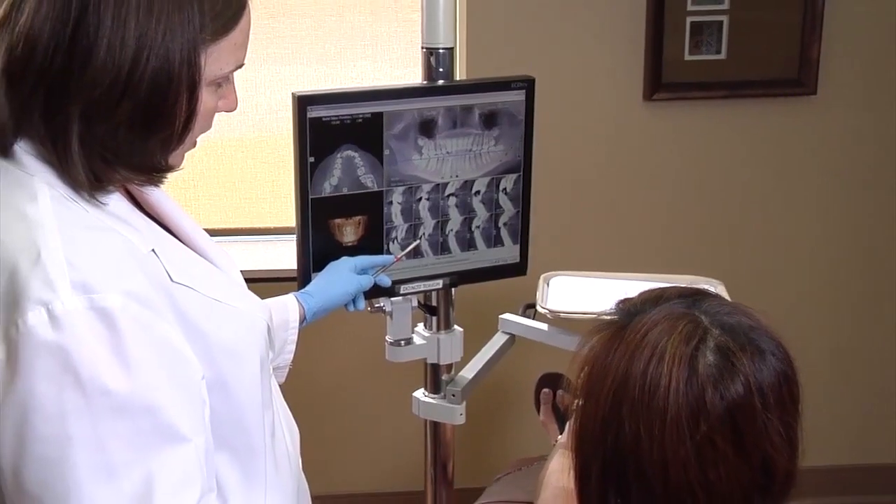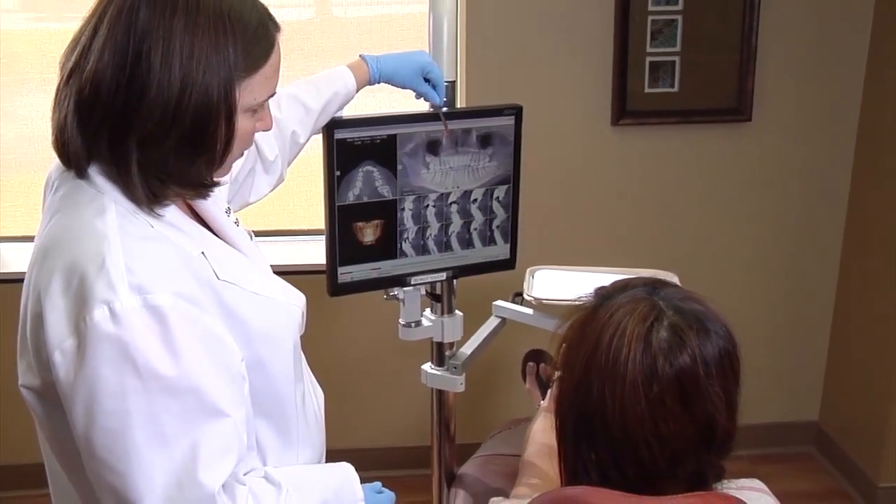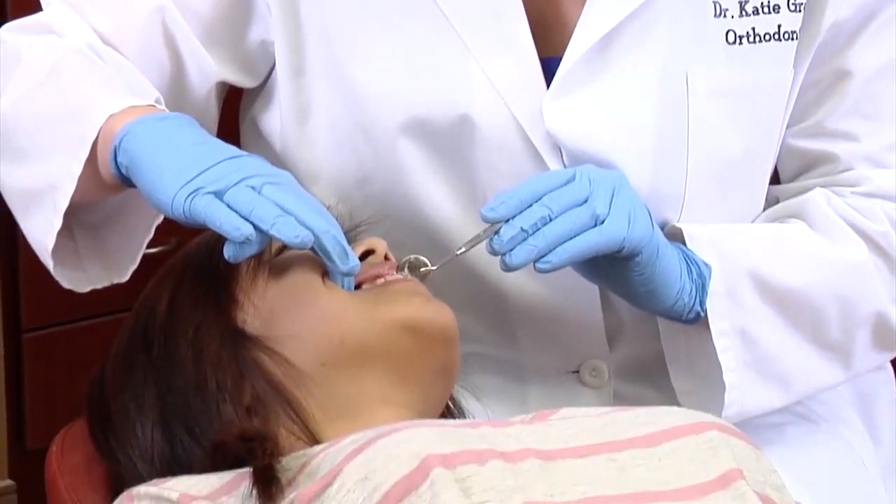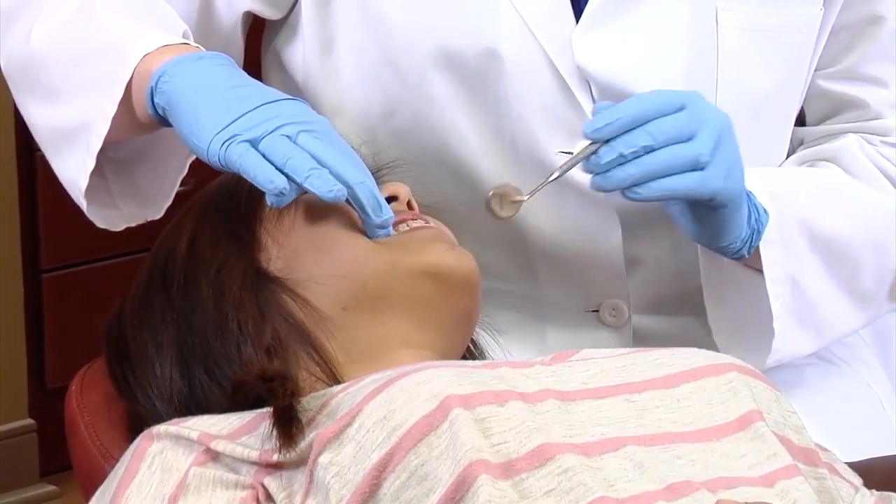The patient may return for orthodontic brace activations and use of the TAD almost immediately. Some patients have their TAD in for only a portion of their treatment — as little as six months — while for others, they have them in for the duration of their orthodontic care. When TADs are required for longer treatment periods, their positions may need to be changed. When treatment is complete, TADs can commonly be removed with no anesthesia or with a topical numbing cream.